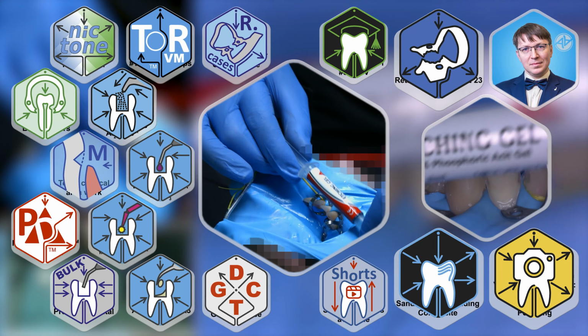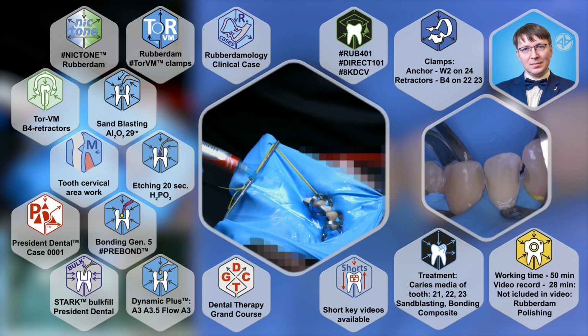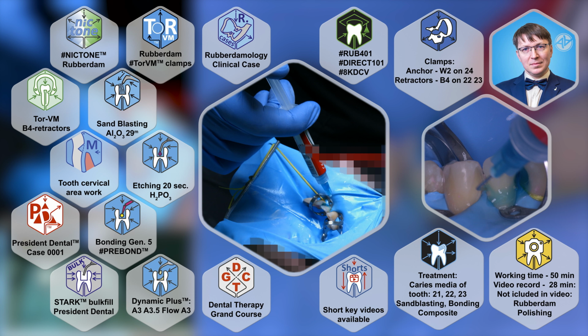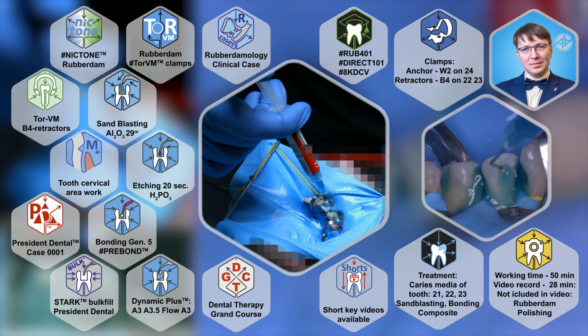Of course, at the center you will look at the main hexagon with the clinical sample, but this is not the main camera. This is the secondary camera with the face, hands and instruments.